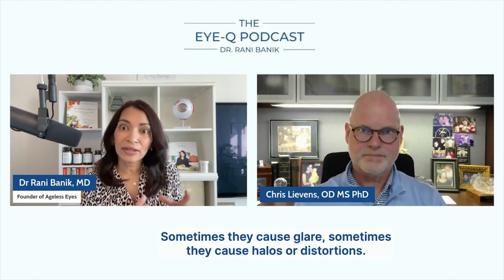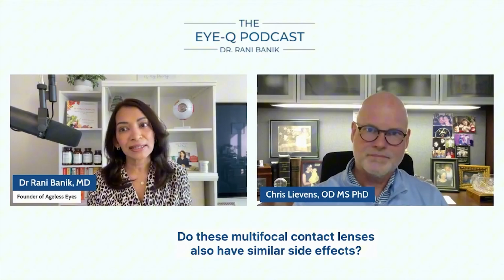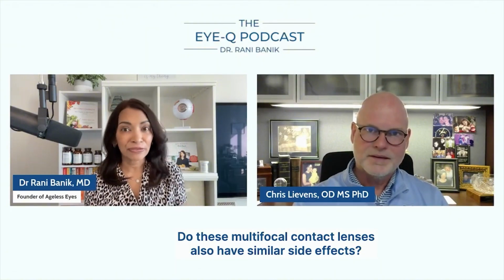For example, I know when it comes to a different type of multifocal lens, for example, post-cataract surgery, there are these lenses that can be put into the eye. Sometimes they cause glare, sometimes they cause halos or distortions. Do these multifocal contact lenses also have similar side effects?